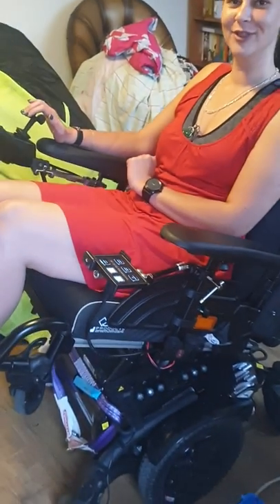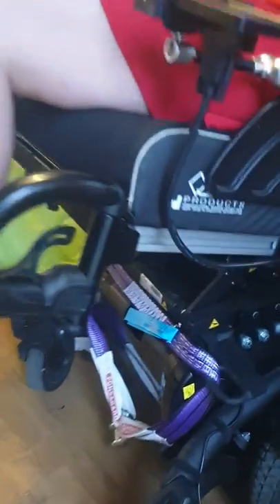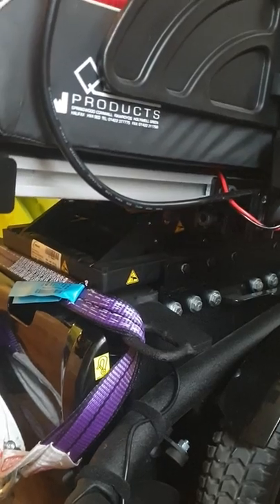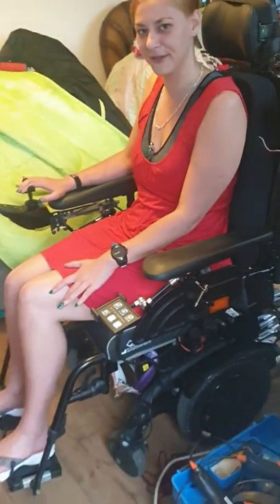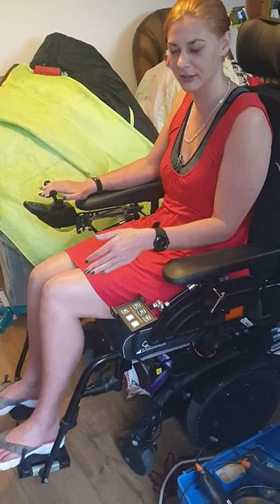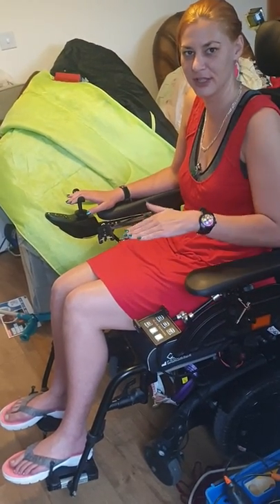So the trick for this is that I can tip myself at an angle and it can go all the way back — I could fully sunbathe in it. You can go fully back and effectively sleep in it. And it's an incredibly smooth move as well, because it doesn't hurt, which usually it would. The reason I have that as a feature is so that I can get in and out of it easily. If I'm really sore, I can tip so the footrest is to the side, making it an easier lift-off.